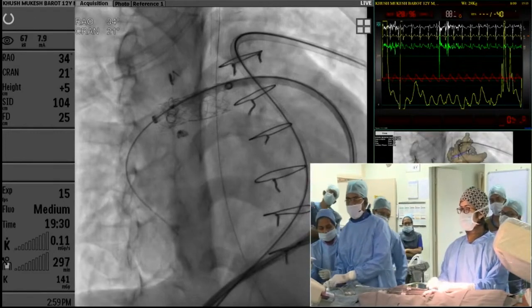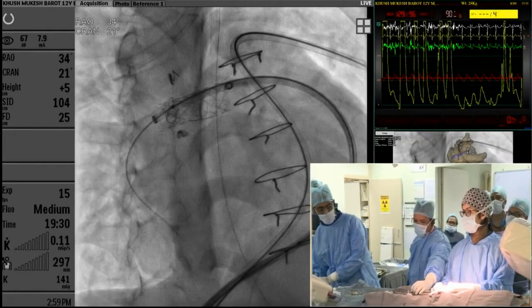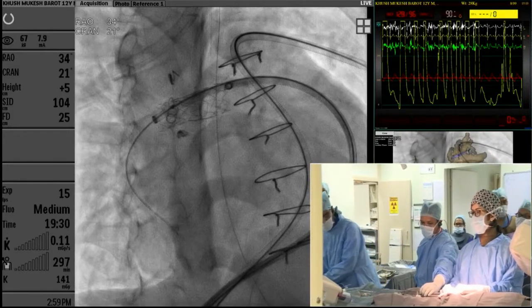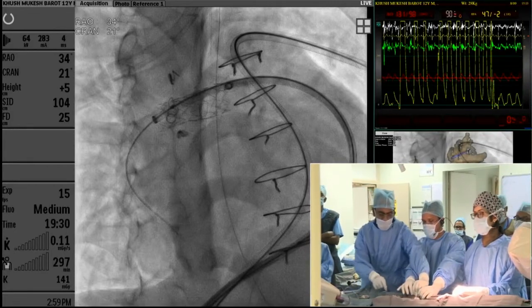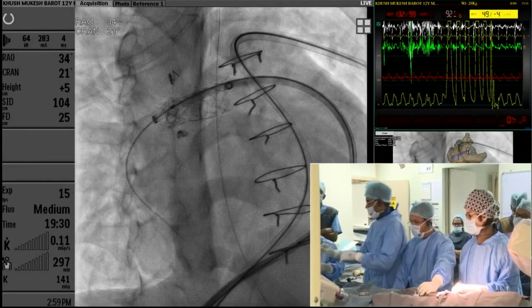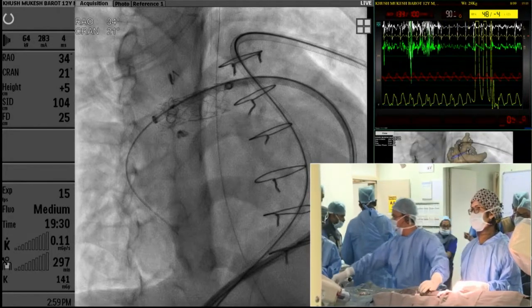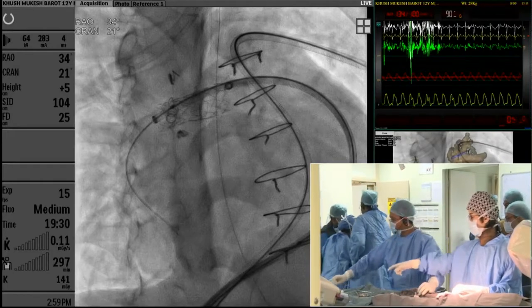Okay, we will see what the distal RPA pressure is later. While I am mounting the second stent on the left, Dr. Devashree and Dr. Aravind will record the distal RPA pressures now. The second stent mounting is going to be exactly similar to the first stent. Open out another 28 Zephyr. This stent is called Zephyr, Z-E-P-H-Y-R.